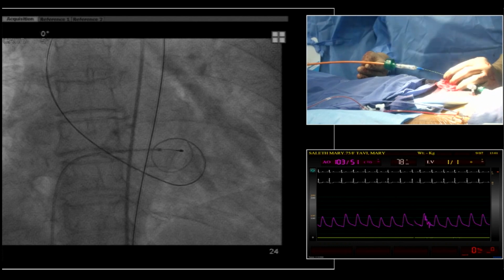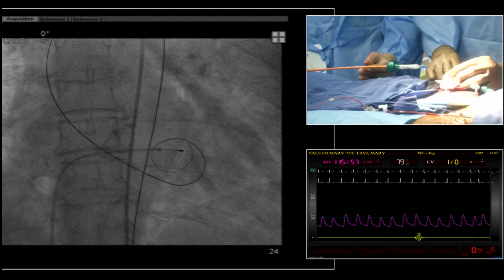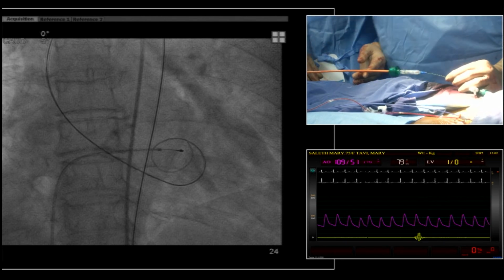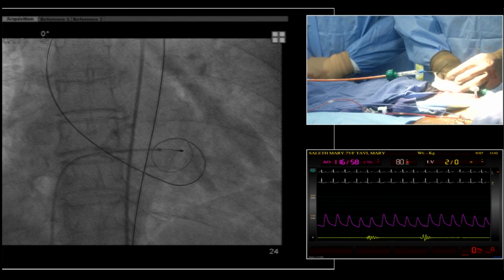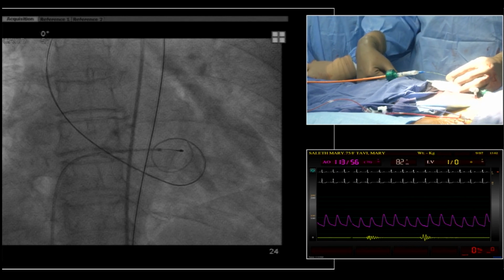So that's important. The second aspect is that you have to get the right balance between an adequate orifice, having moved the calcification away, and not creating an aortic regurgitation. Sorry, that's not a paravalvular leak, it's an aortic regurgitation. The best balance lies between 18 and 20 millimeters.